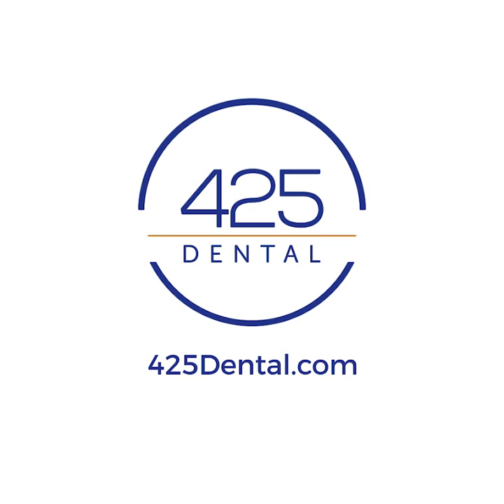Do not put your aligners in your pocket without a case, as they will break. The rule is if it's not in your face, it's in your case. Keep them away from your pets. Your dog will definitely turn them into a chew toy, even if it is in the case. The most common way to lose an aligner is to wrap it in a napkin and accidentally throw it away.